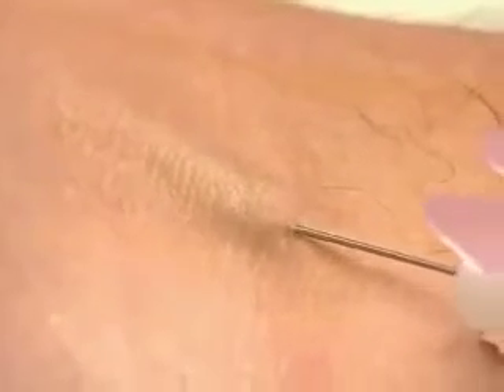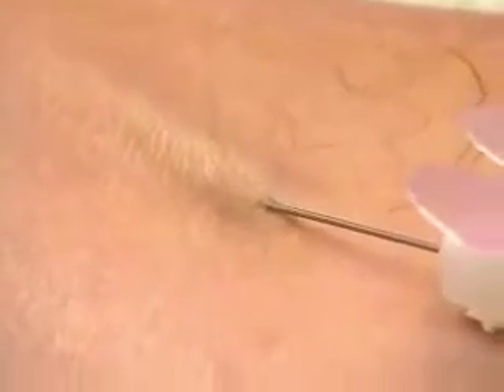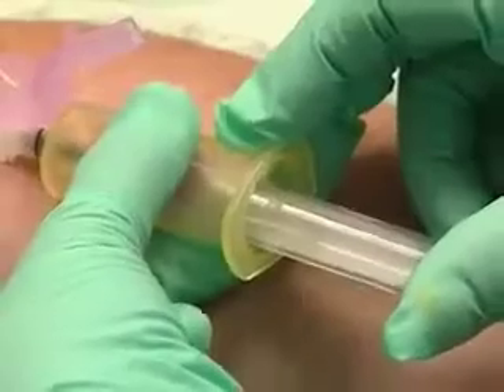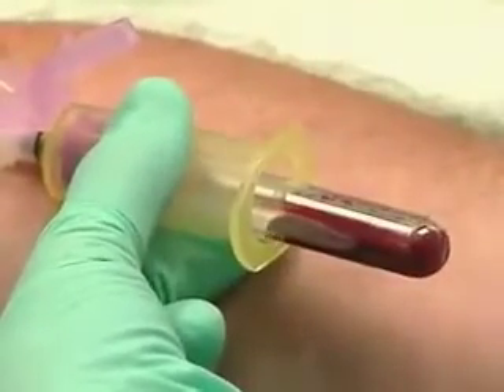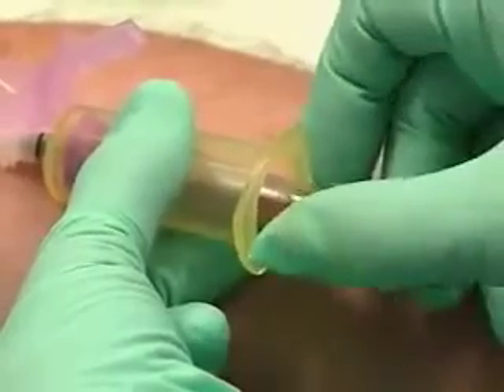Take a shallow approach to the vein. The blood flashing back into the vacutainer confirms you're in. If you don't see the flashback, stop.